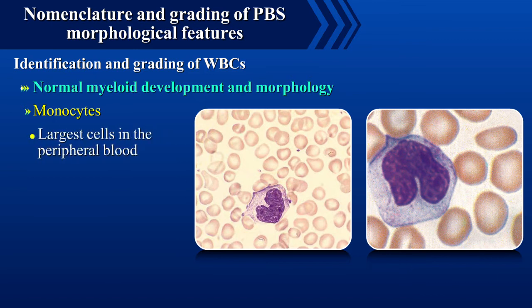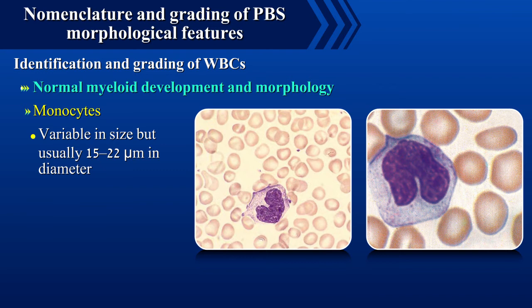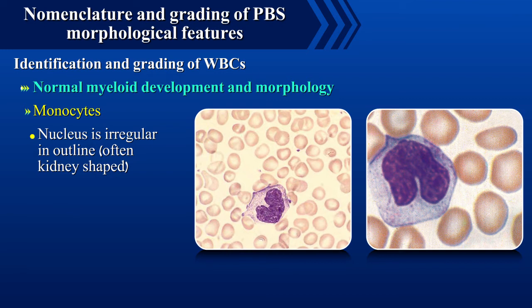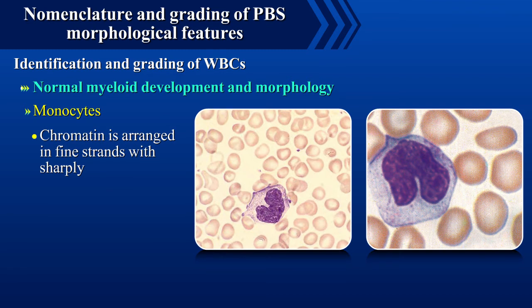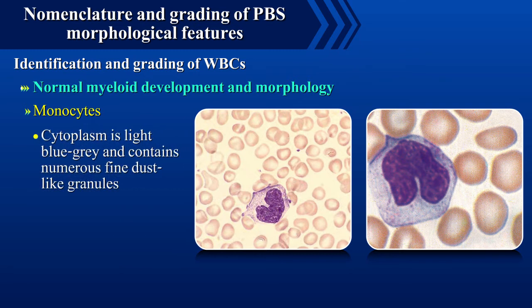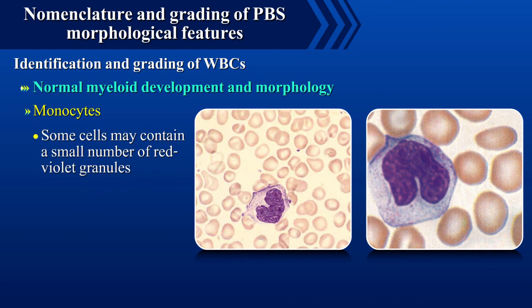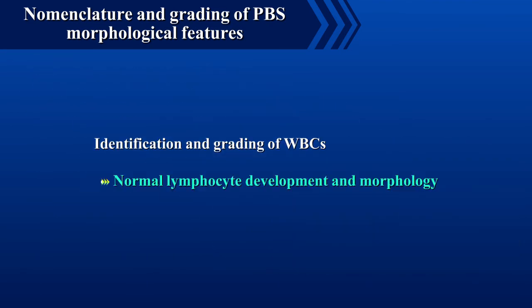Monocytes are the largest cells in the peripheral blood, variable in size but usually 15 to 22 microns in diameter. The nucleus is irregular in outline, often kidney shaped, and chromatin is arranged in fine strands with sharply defined margins. The cytoplasm is light blue to grey and contains numerous fine dust-like granules. Some cells may contain a small number of red to violet granules. Vacuolation may be present.